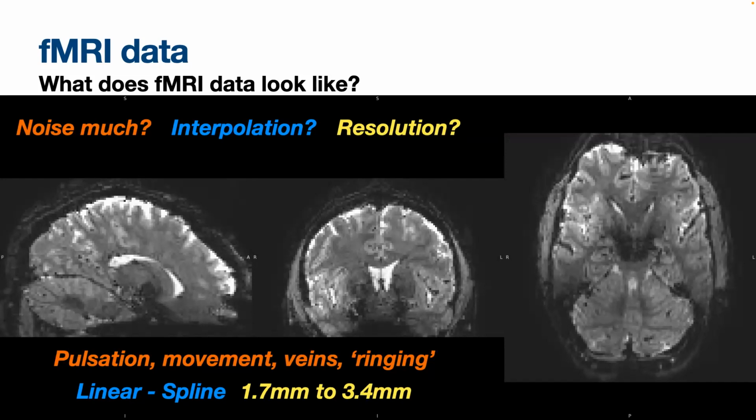Is the upscaling methods with AI used? Yes, that is an active area of research at the Spinoza Center. We are actually doing things like compressed sensing. I don't know if you're sort of familiar with that sort of technique, but you can, in principle, make very sparse measurements. So you don't have to record every voxel. I'm speaking in metaphor here, but you don't have to record everything. You can record very sparsely, and then what we call reconstruction.